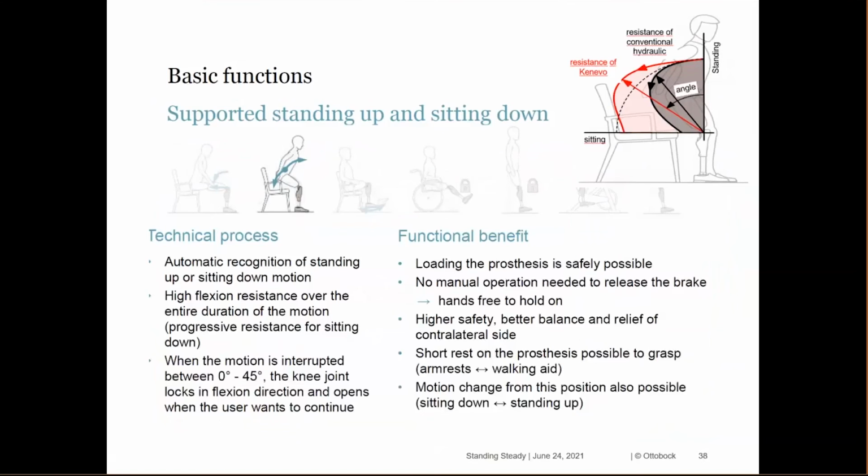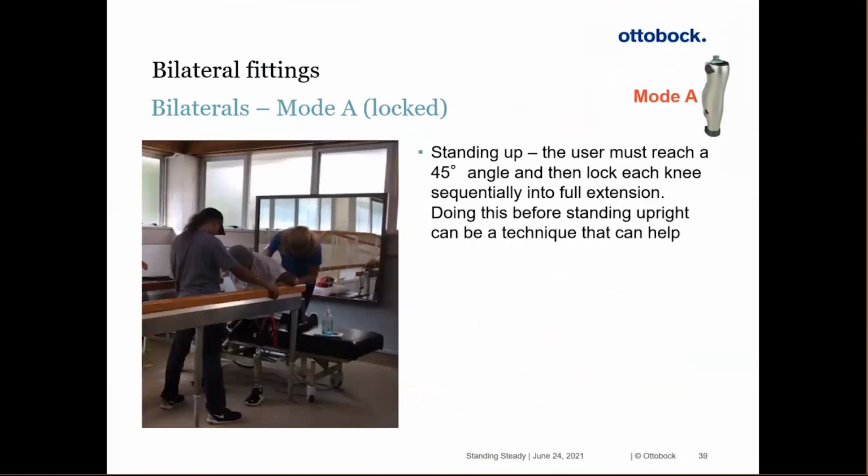When they do sit, there's this progressive sitting, so they're able to get control throughout the whole range of sitting, rather than initially there's resistance and then it drops out as they progress. So some pretty cool features for both standing up and sitting down.